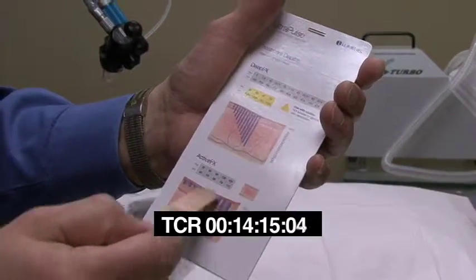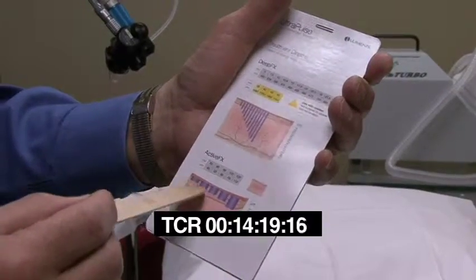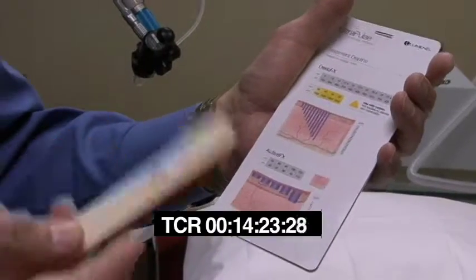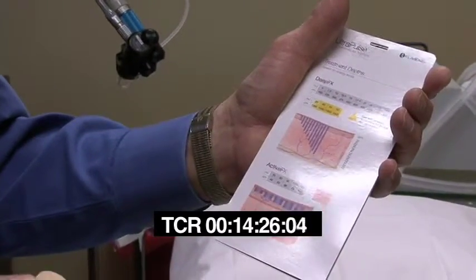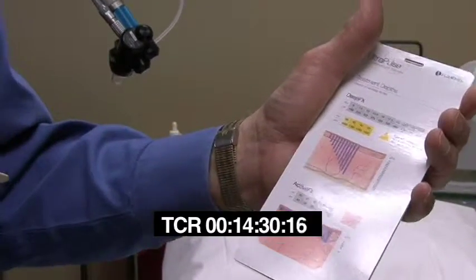So this is the epidermis again. This is the upper layer of the dermis. With the active FX, we're only going into the epidermal layer, so we're basically treating pigmentation problems, as well as making the pores smaller and treating some of the finer facial lines.